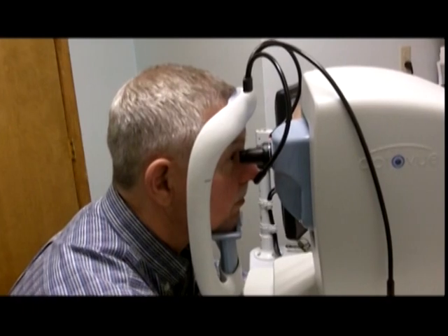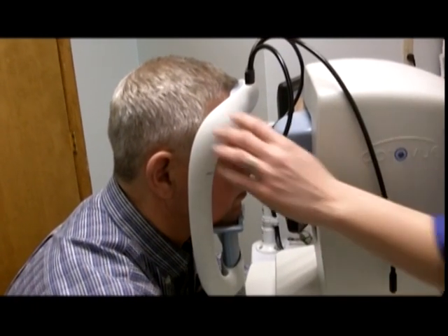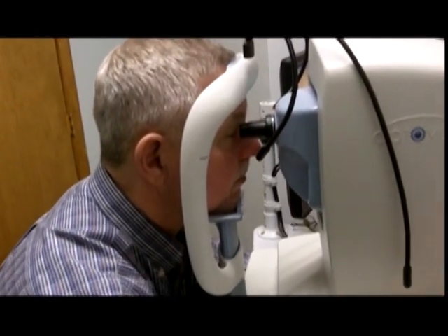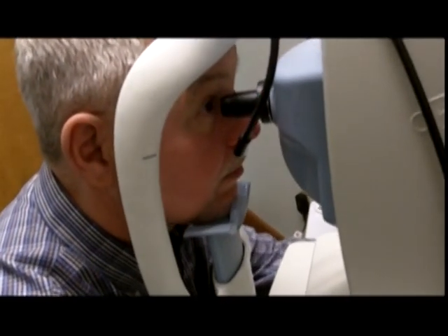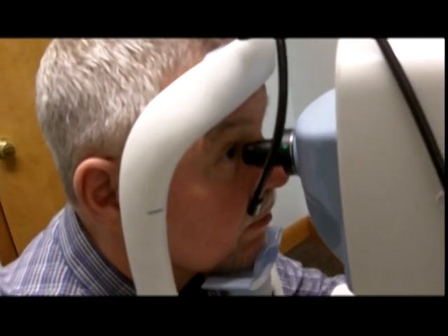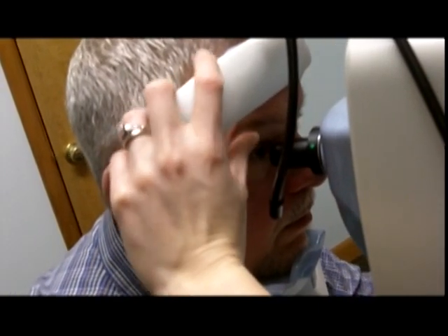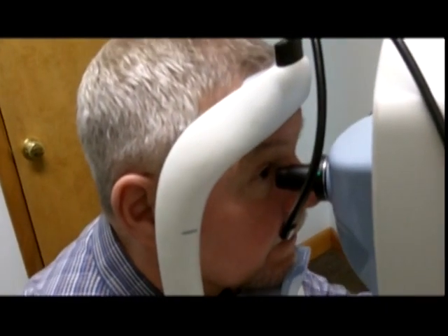While doing scans on the lens, it's important to keep the eyelid out of the way. When you do a cross line scan, the patient can usually open their eyelid wide enough. If you say "open real wide for me," the top lid is out of the way. Some patients have tiny eyes and you're going to have to grab the top lid even for a cross line to get it out of the way. He did a fine job keeping his eyes nice and open.